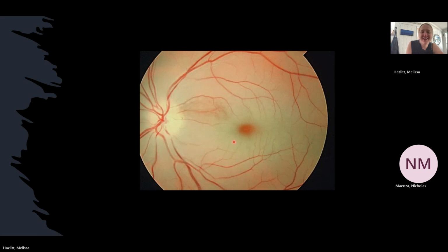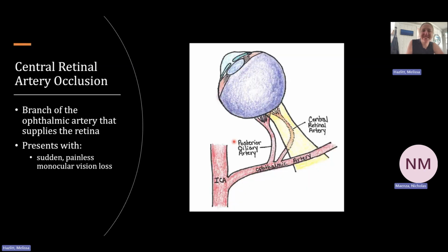Yeah, what's this one? This is central retinal artery occlusion. Artery occlusion. See, some things stay with us long after medical school. So now we're getting into some of the painless causes of vision loss that I hadn't historically used ultrasound for, but that you can have secondary indicators in addition to sometimes actually being able to visualize the clot. So just that reminder that it is a branch of the ophthalmic artery, and that it travels with the optic nerve to supply the retina.